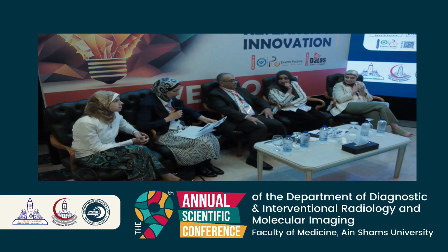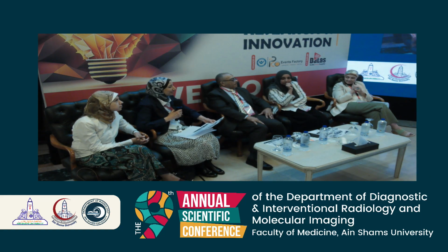Imaging of the musculoskeletal complications associated with immune deficient disorders in pediatrics.